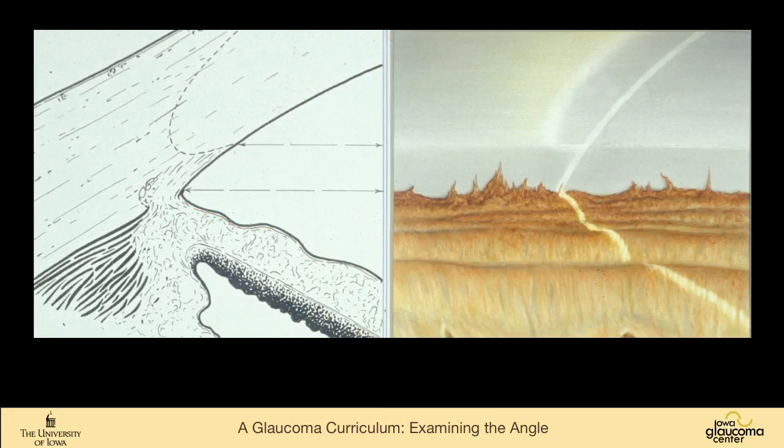This we've seen before as well. This inserts into the trabecular meshwork, so we don't even see scleral spur in this. That would make it a B. The angular width is 50 degrees. The iris is flat. There's no pigmentation. So B50F0.